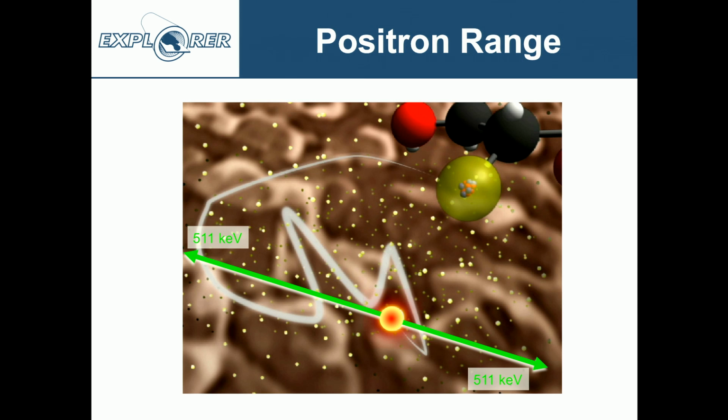And there's a couple of physics factors that are going to eventually limit us. First of all, positron range, the fact that the positron travels some distance from the site at which it's produced before it annihilates with an electron to produce the back-to-back annihilation photons that we subsequently detect. And the range that matters here is this distance shown by the blue line here. And the positron range depends on the energy spectrum of the emitted positrons.